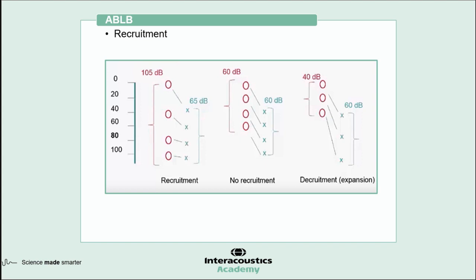What I was trying to do today is give you an idea of what the options are available out there, and to encourage people to think beyond the audiogram. But certainly if you're dealing with a binaural or bilateral hearing loss, then uncomfortable loudness levels will give you the information that the ABLB wouldn't be suitable for. So you need to pick and choose according to your case individually, for sure.